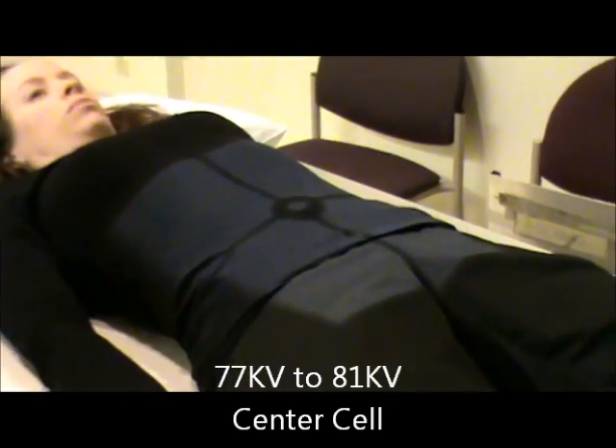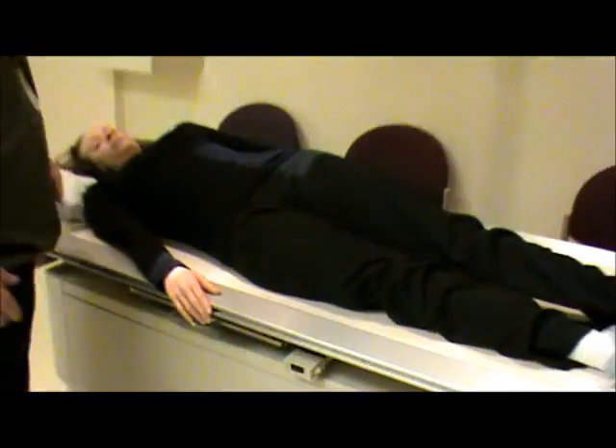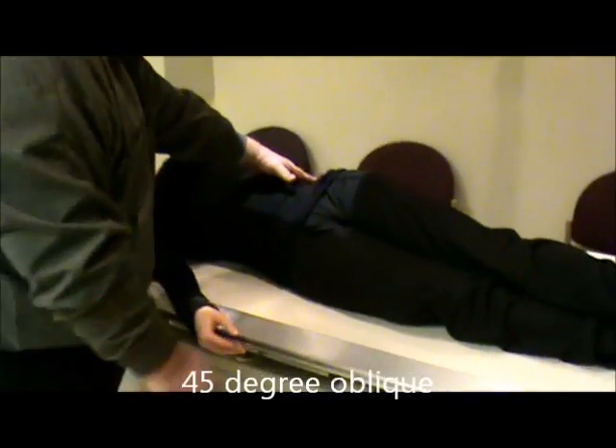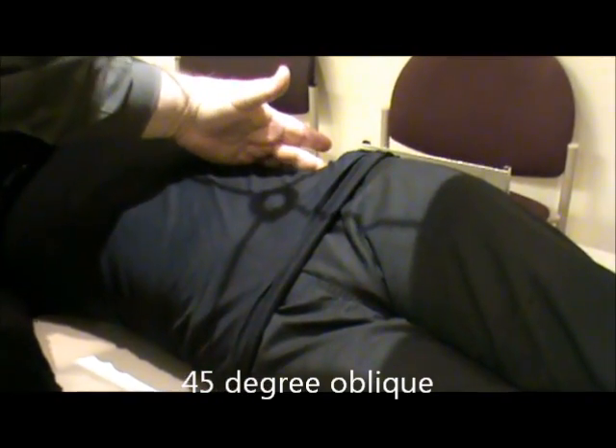Then we're going to use the sponge here. We're going to have the patient roll up toward me and put the sponge behind him — about a 45-degree oblique. Our centering: we're going to palpate the crest, level to the crest, and center to the middle of the patient in their oblique. We should see a little bit of light on both sides. We're going to use the right marker because it is a right posterior oblique.